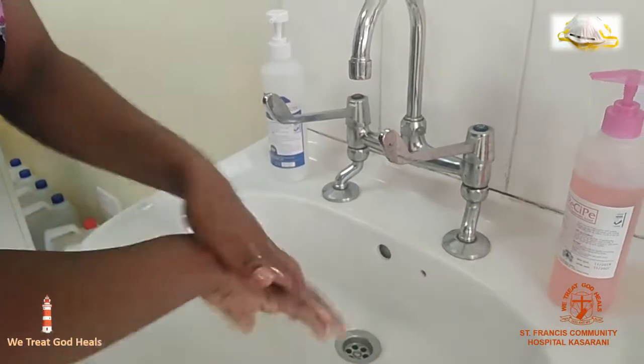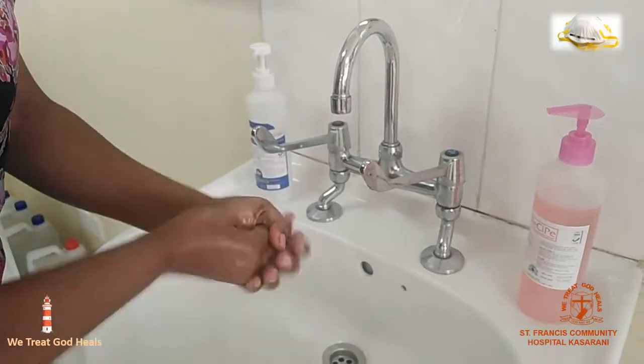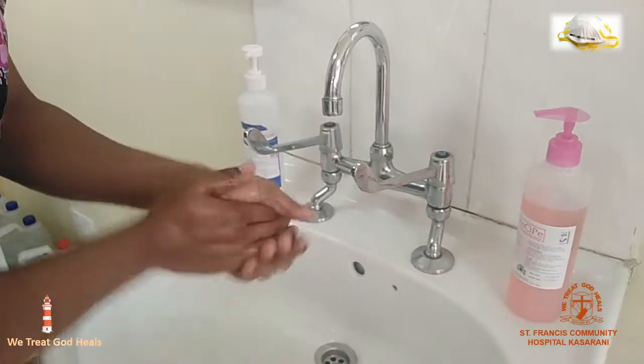Select the N95 mask that fits you well according to your size. We have different sizes and models.